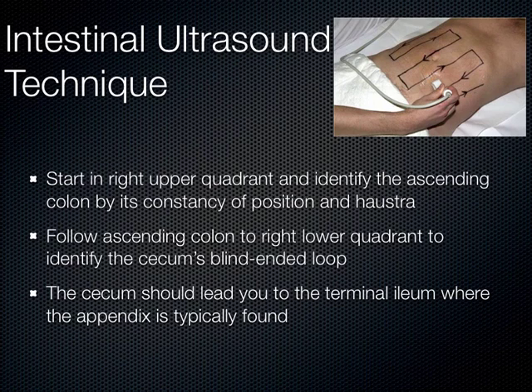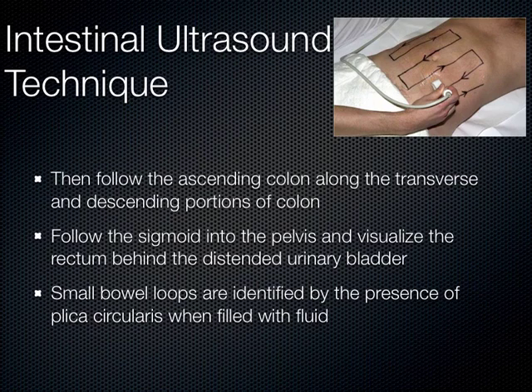You follow the ascending colon down to the right lower quadrant where the appendix would be — the cecum has a blind-ended loop, and the appendix pops right off the terminal ileum. From there, continue mowing the lawn back up the ascending colon, across the transverse colon, and down the descending colon all the way to the sigmoid and into the pelvis. Do this in both a transverse and sagittal plane.